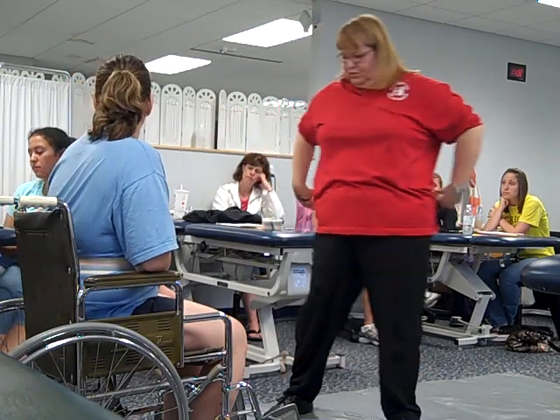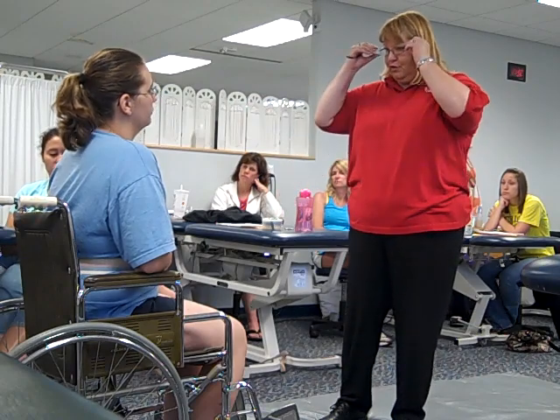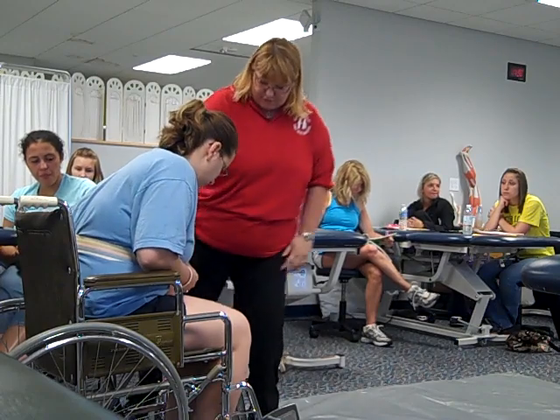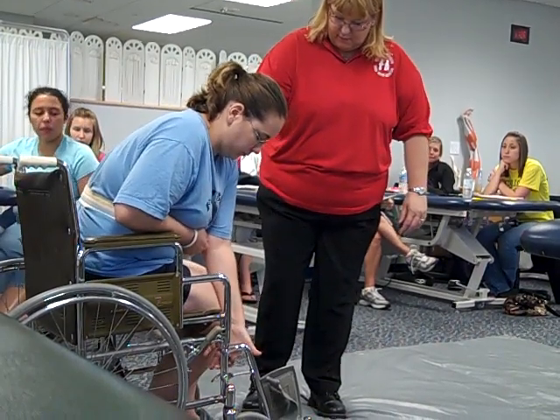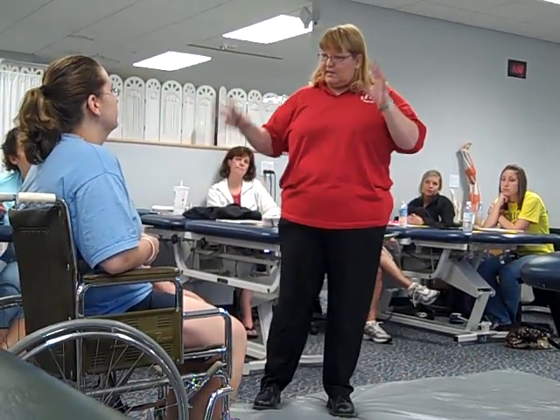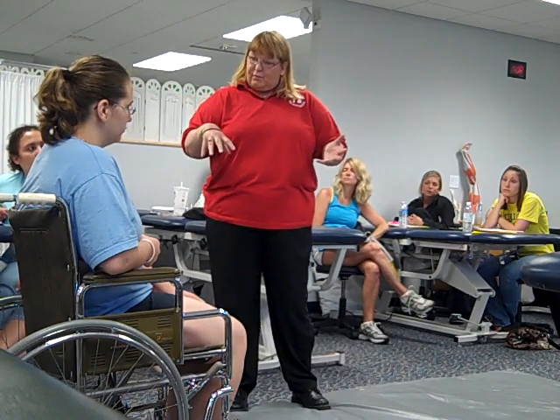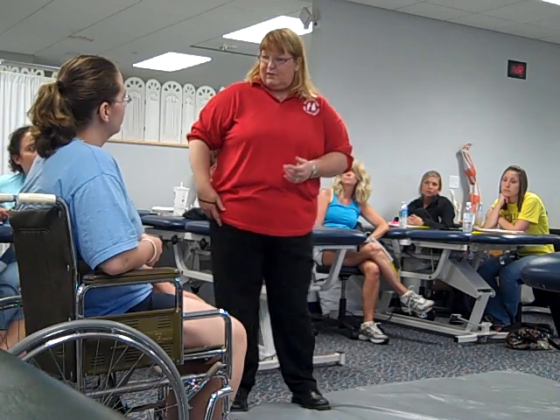So you have weakness on your right side, so your left side is going to be really helpful to you as we're going through this whole process. What we're going to do is we're going to get the footrests out of the way, so you can reach right there and get that flag, and push it up, and swipe up to the side. Same thing in the middle there. What we're going to be doing is to get down to the mat — you're going to move your feet forward, cross your legs, scoot your bottom forward, turn so that your tummy is on the chair, and then you're going to go down onto the mat, and I'm going to have you just kind of sit to one side.